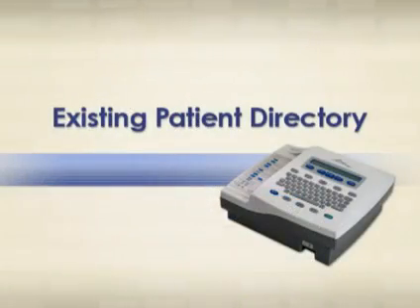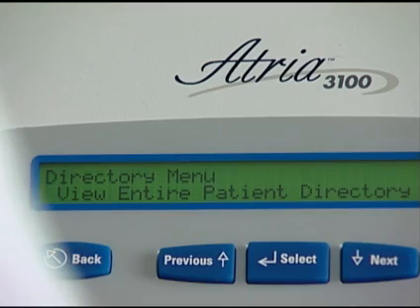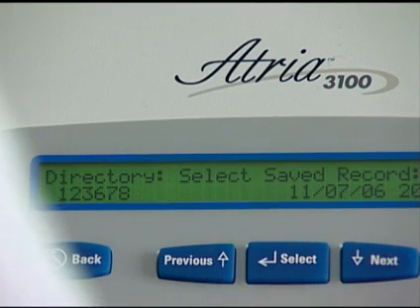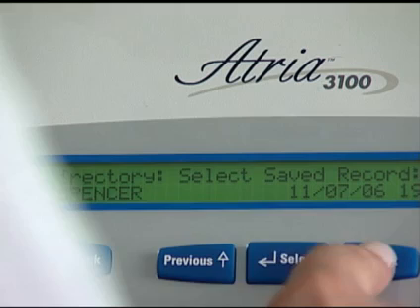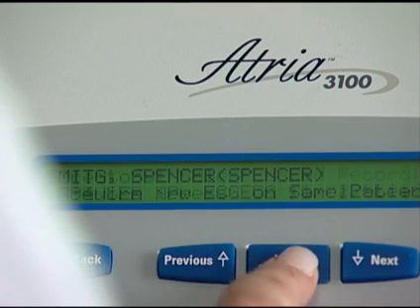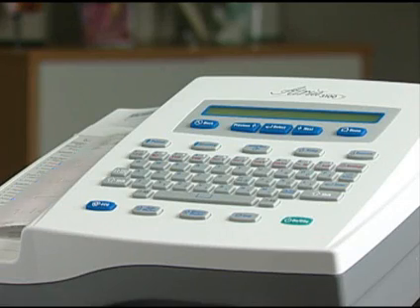To access demographic information on an existing patient, press the Directory key. View Entire Patient Directory will appear on the screen. Press Select. Select Saved Record will appear on the screen. Scroll to locate patient. Press Select. Acquire New ECG on Same Patient will appear on the screen. Press Select. Your ECG report will then print.